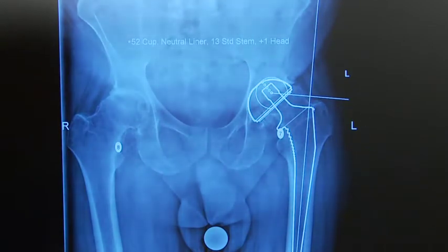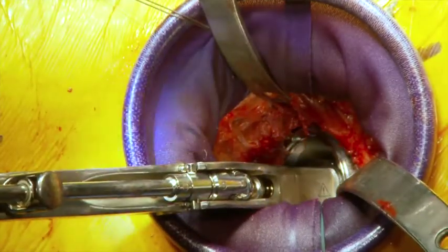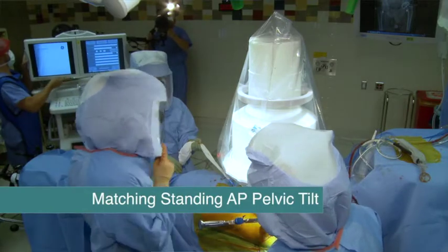But we'll see how it plays out in the surgery, and I'll show you those films. But again, here's all of my component positioning and component size information that we have preoperatively to help us in surgery. And so we'll move on to our fluoroscopy of this case. We'll start again with our cup placement as we usually do.